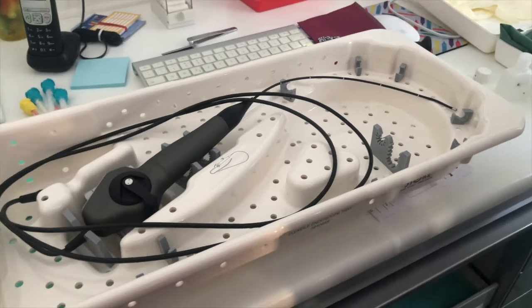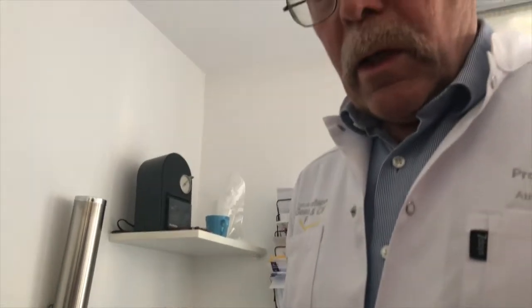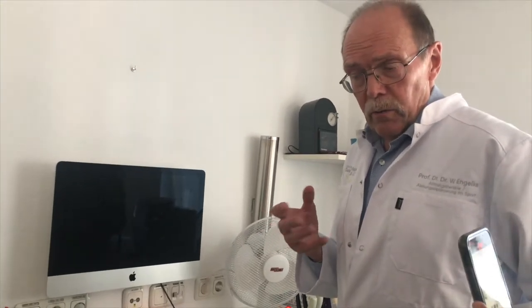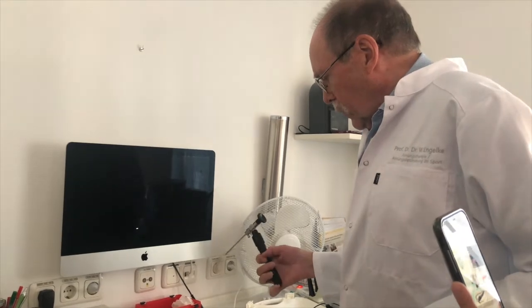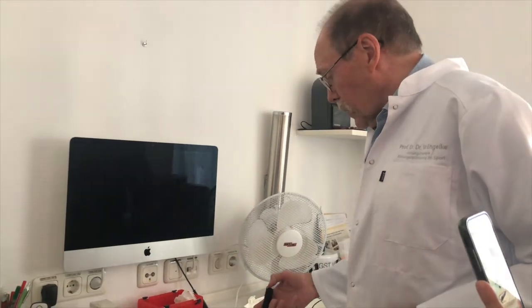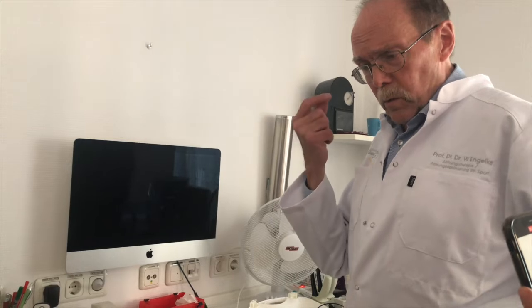The endoscope can be used in children, of course. And I did a lot of endoscopy with children. When checking the anatomy of the nose, you should place first the endoscope in the entrance of the nose and check if there is any septum deviation or swelling of the turbinates. That's right. That we're going to do now. And if the turbinates are fine, also checking the adenoids. The adenoids we also can check with this endoscope very easily, because for adenoids, it is not necessary to enter to the posterior part, but it can be done entering only two centimeters, then it's already possible to have a good vision of the adenoids.